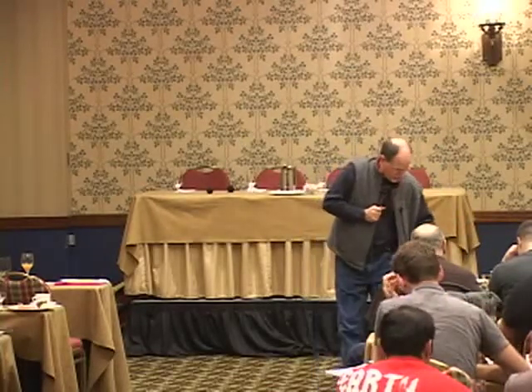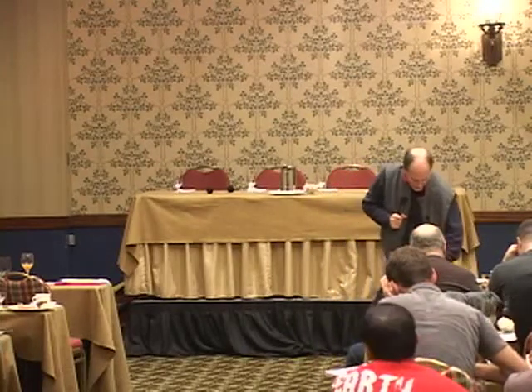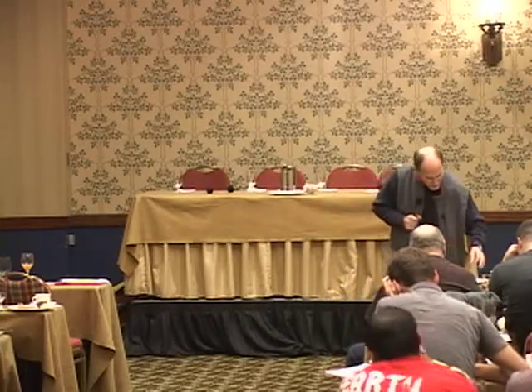Now they talk about radiation risk, that the number here is 24 millisieverts, which is equal to 250 chest x-rays, which is like flying back and forth to Denver 200 almost every day of the year. These numbers are a changing target. I will give you our numbers for these. I just got them from our radiologist. I emailed him last night and asked.